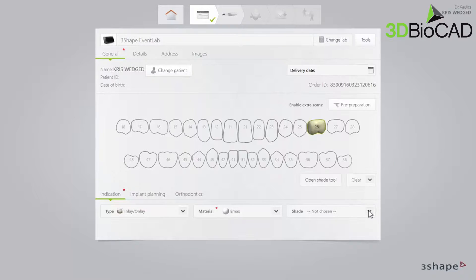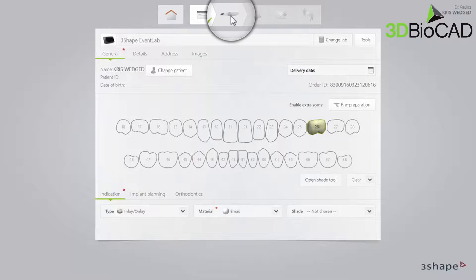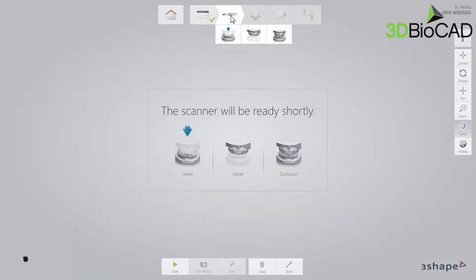Now you are ready to scan. Press the Scan Workflow step in the top workflow bar. Use retraction cord and/or hemostatic agents if parts of the margin are subgingival.